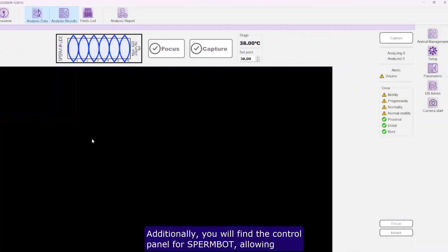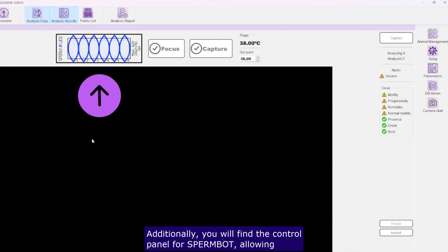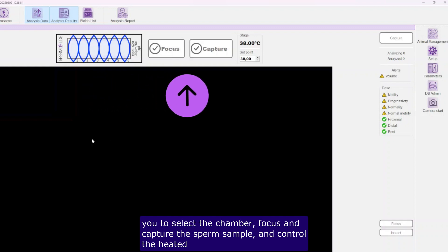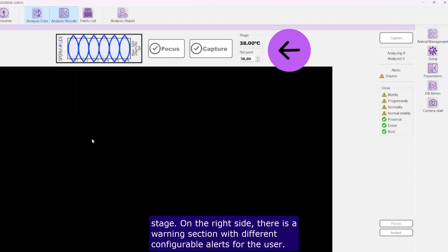Additionally, you will find the control panel for Spermbot, allowing you to select the chamber, focus and capture the sperm sample, and control the heated stage.